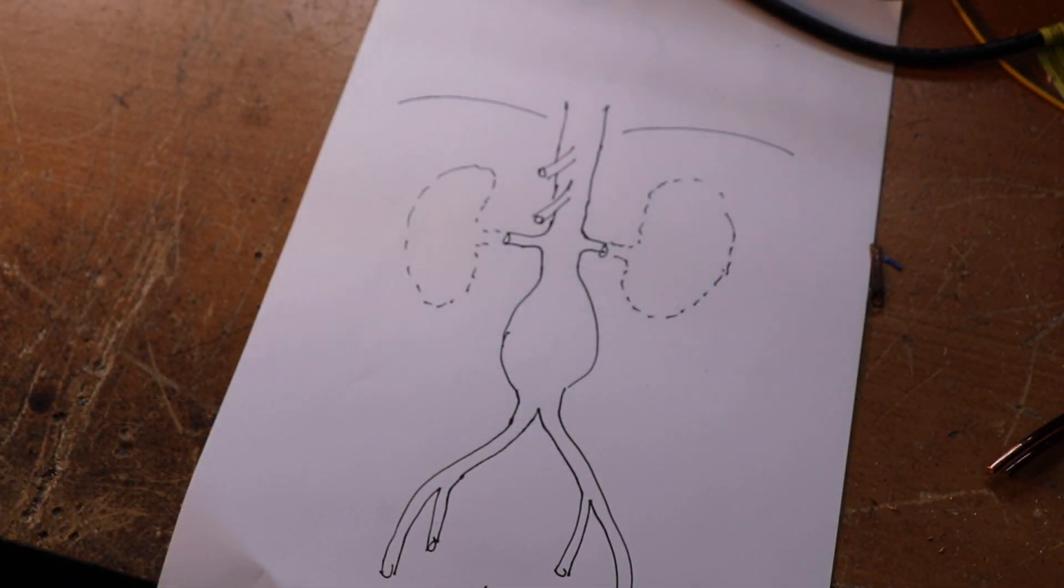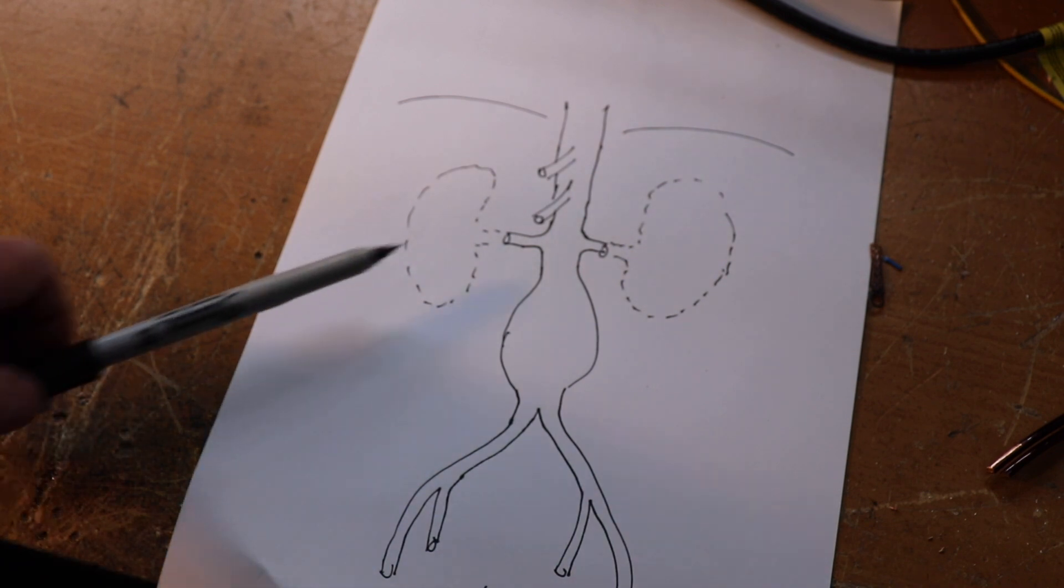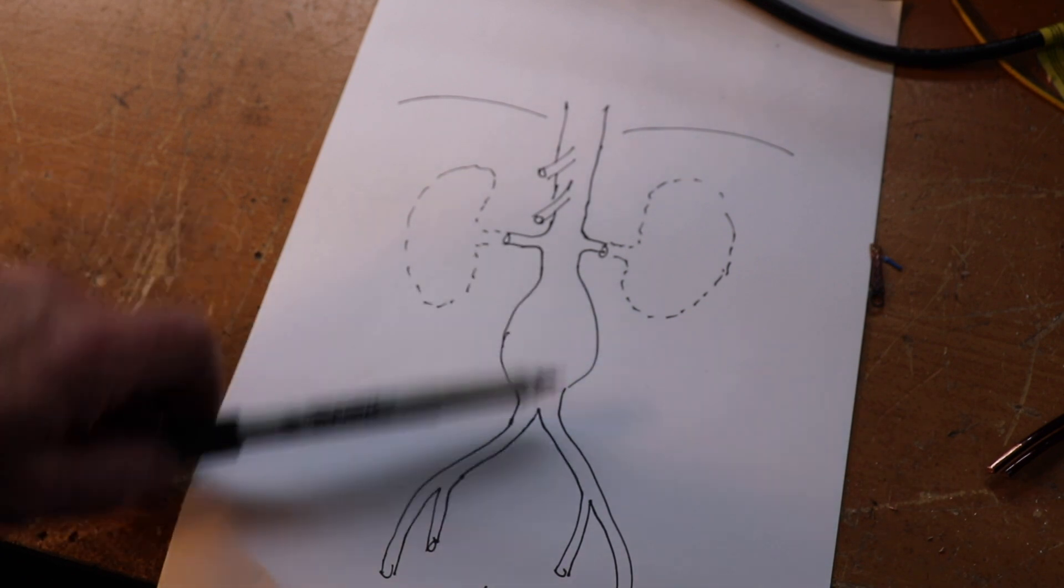Before we look at these grafts in more detail, I thought I would just go over a bit of the anatomy and the indications for when we use these things. The grafts I'm going to show you this evening are basically used for repairing aortic aneurysms.